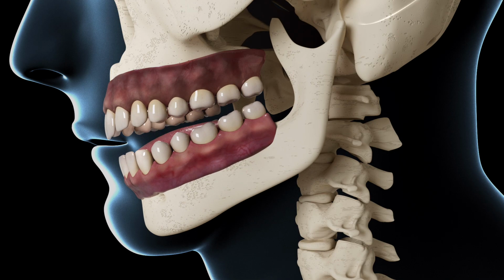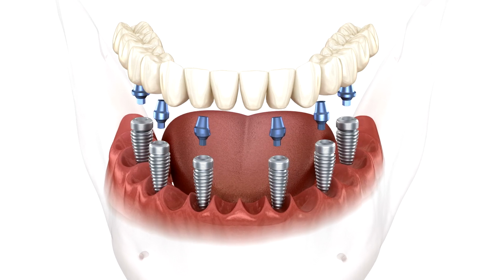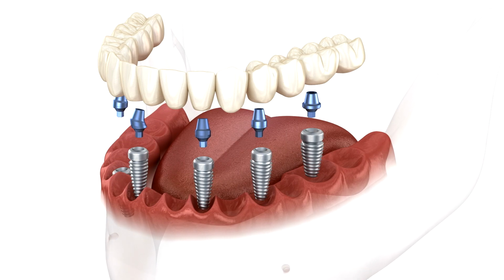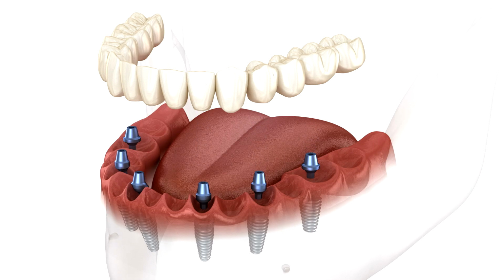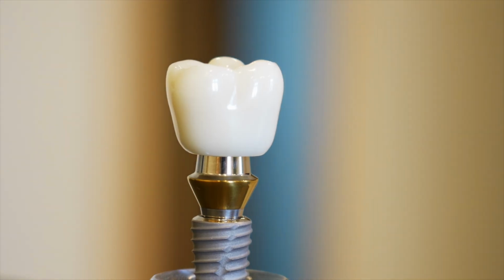They're excellent for achieving high primary stability in softer bone types, D3 and D4, through self-condensing properties, which is vital for immediate loading protocols. Visual: show tapered implant self-tapping into D4 bone. The thread design is equally critical. Threads are not just for insertion, they are the primary mechanism for transferring occlusal load to the bone.